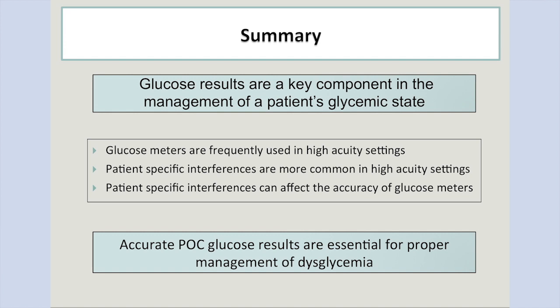And with the cool new models that we have with this simulation stuff, if anybody wants to talk about that, I'd love to share it with you, because we've applied the simulation not just to glucose. We've applied it to INR, point-of-care devices. We're working on it for hemoglobin A1Cs. We're looking at it for creatinine.